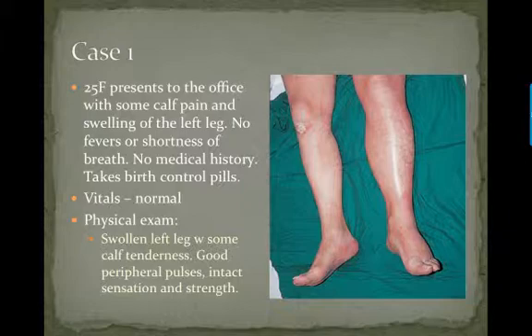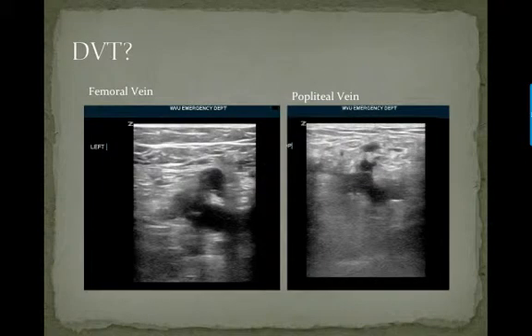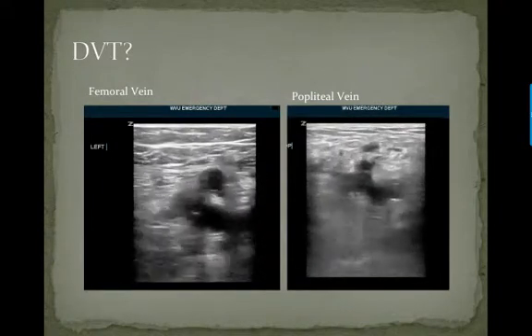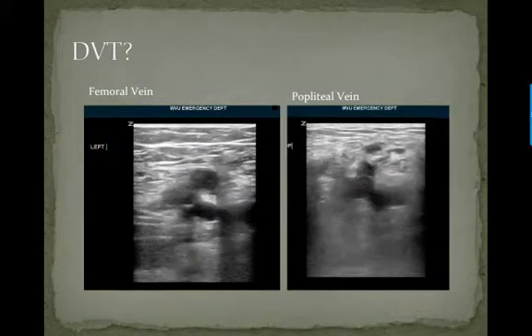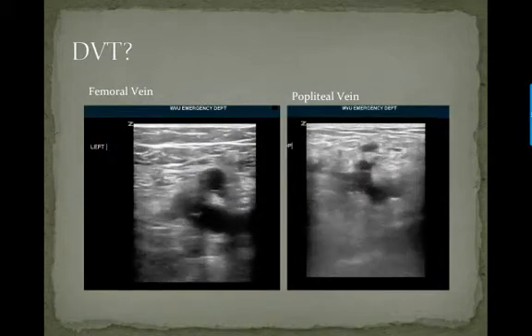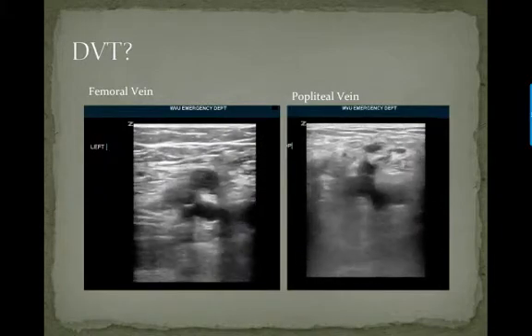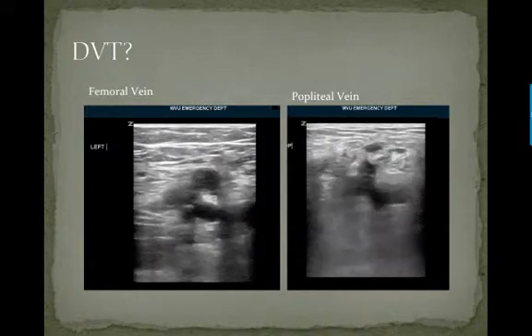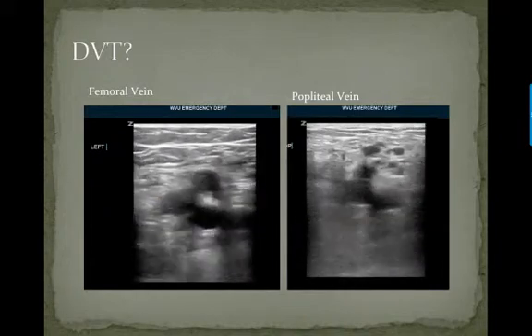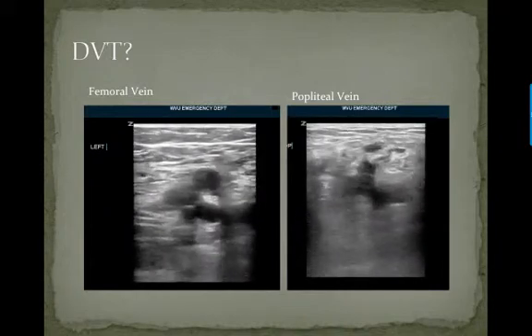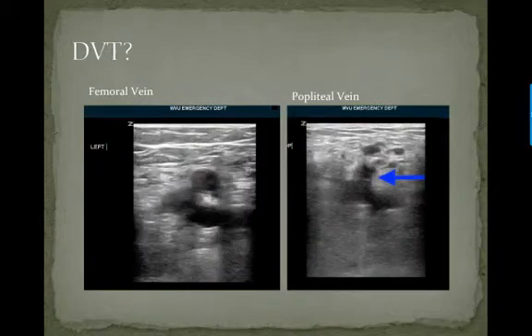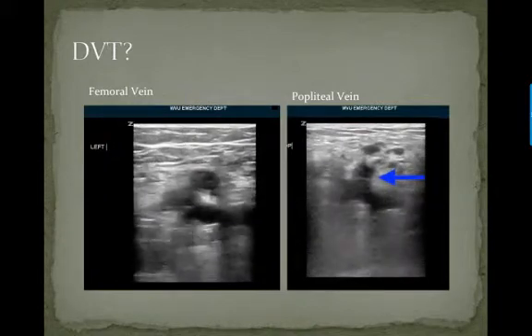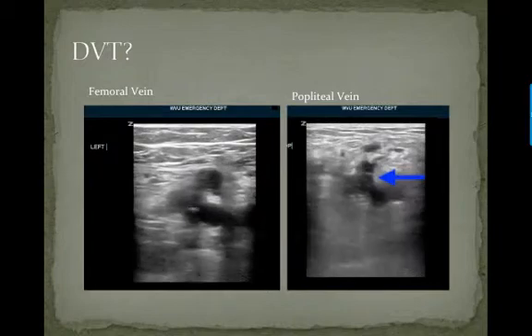Here is your bedside ultrasound that you've just performed. On the left are the femoral vessels and on the right are the popliteal vessels. As you can see on the left, the common femoral vein is not compressing, and on the right the popliteal vein is not compressing. So this patient has a DVT.